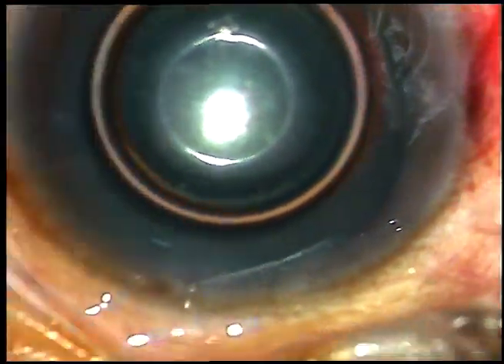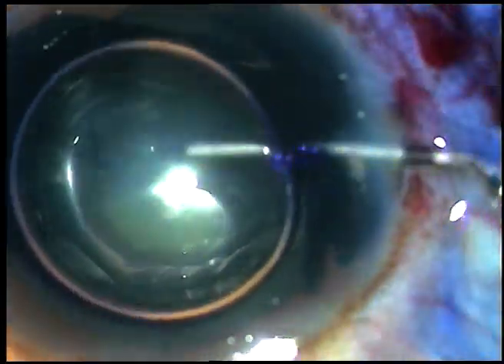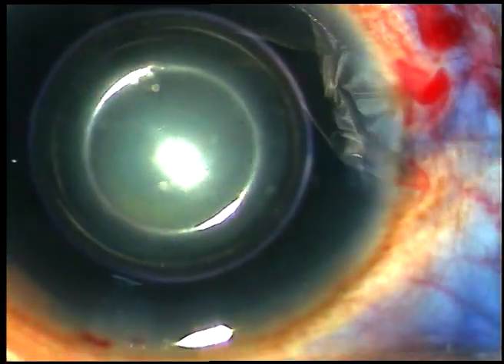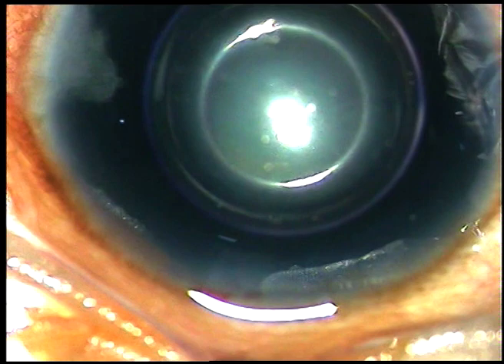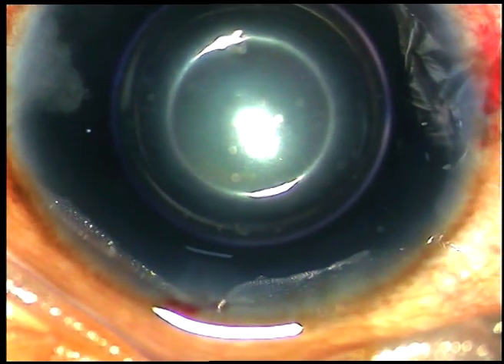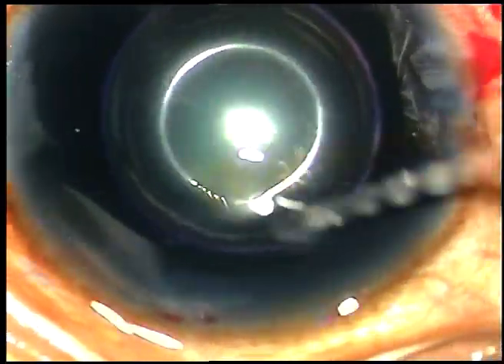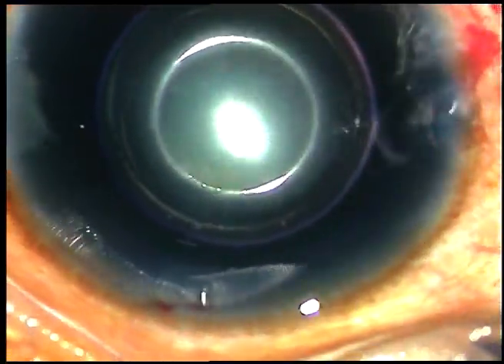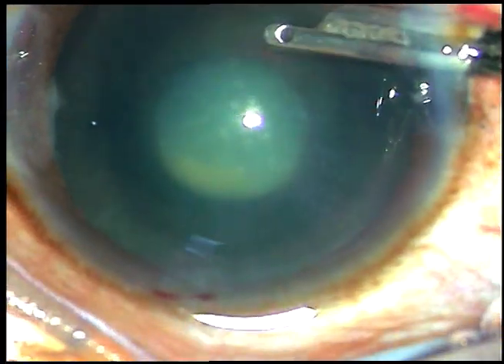I want to stain the anterior capsule with trypan blue dye. Here goes the trypan blue dye underneath the air bubble. Now the dye is to be washed out with the help of BSS — I wash the dye out of the anterior chamber.